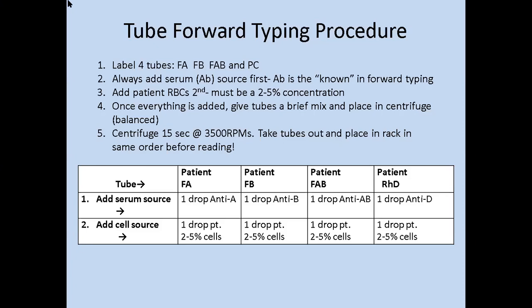I think it's really bad technique to take the tube out and read it as you're taking it out, because you might not be taking them out in order, and that's when mistakes are made. And in blood banking, there is really 0 room for mistakes, because mistyping someone could lead to them getting an incompatible blood type and death within minutes.